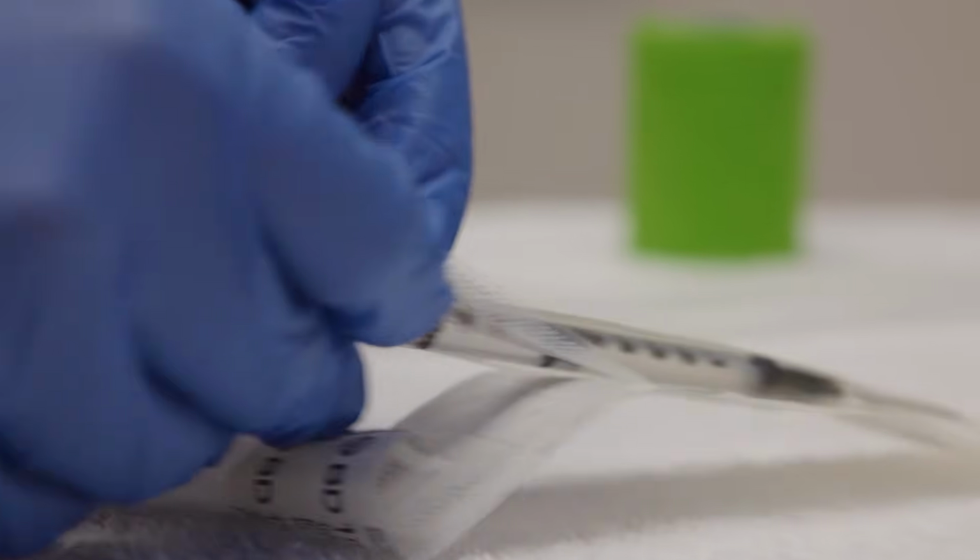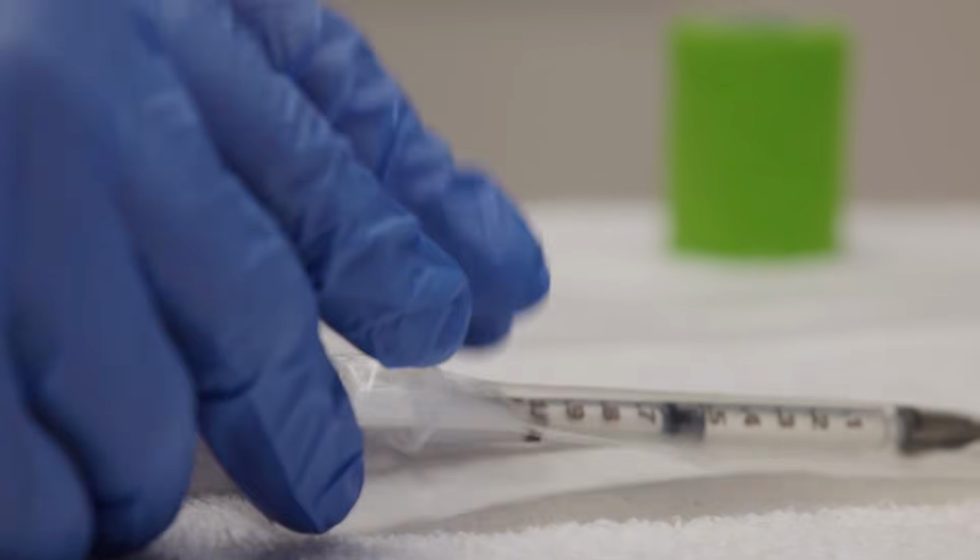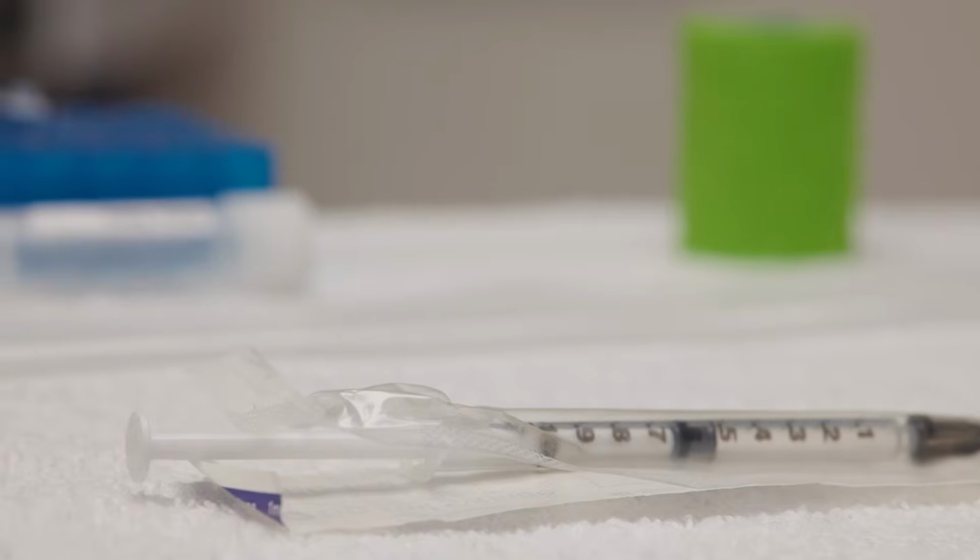This draws in enough air to expel the sweat from the coil tubing after collection. Once prepared, return the syringe to its protective wrapper. If other equipment is used for removing sweat, follow the manufacturer's instructions.